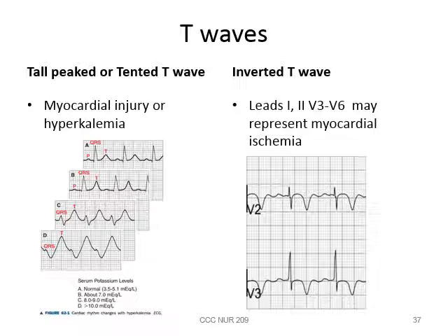It tells me that there's not enough blood flow, that either the oxygen demand has outgrown the oxygen supply, or we're decreasing the oxygen supply to the heart muscle. So that we need to take a look at. We need to look at our patient and see what's going on.